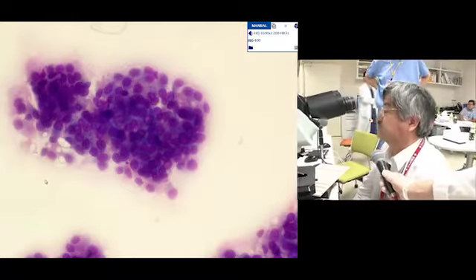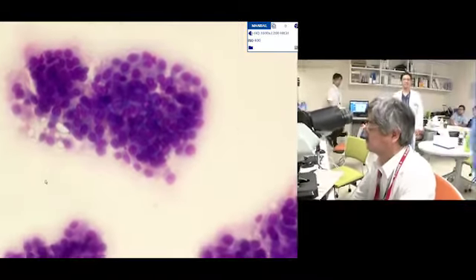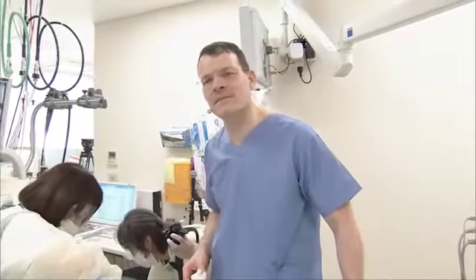Yes, Rob. Stefan. Haru. Kushima sensei, the pathologist, mentioned that this is definitely a neoplasia, at least. So we still have some discussion of high-grade dysplasia or well-differentiated adenocarcinoma. But anyway, the pathologist agreed that the patient receives some excision of the tumor. Is it okay from your clinical point of view? Yes, I think that fits everything.